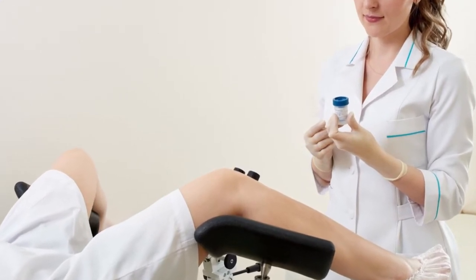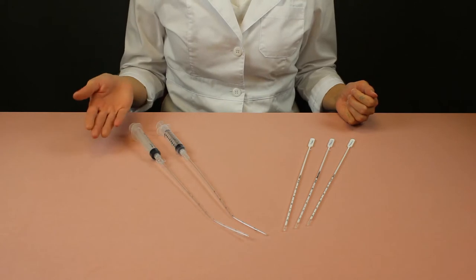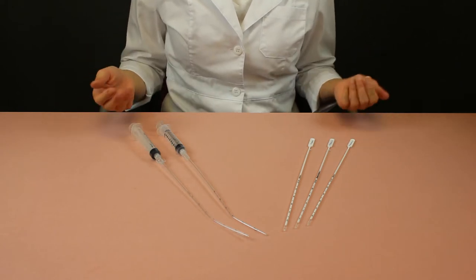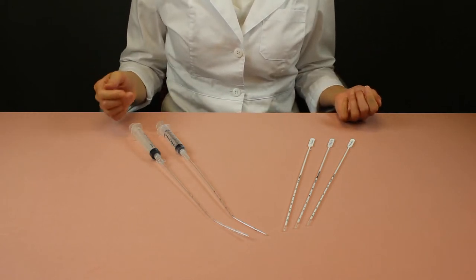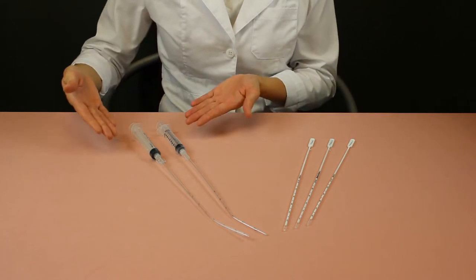Endometrial biopsies are a routine procedure in OBGYN clinics. Because the viability of the tissue sample is imperative in determining a patient's health, MedGyne developed the endosampler and the endosampler II.